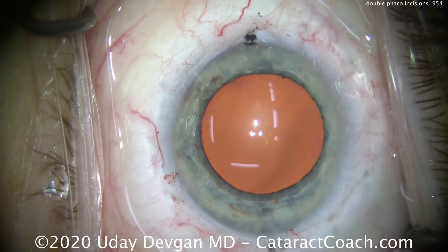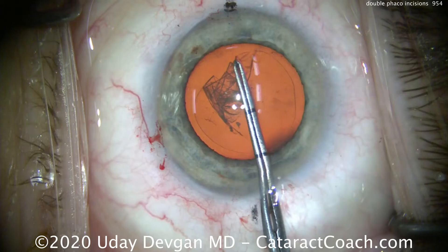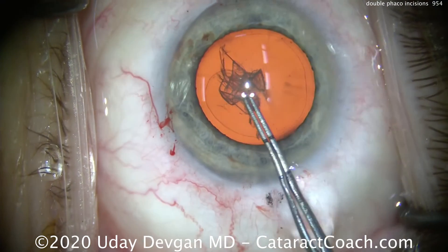Now you have two incisions that are paired, and they're going to help treat against-the-rule astigmatism. They'll give half a diopter to one diopter of flattening, with an average of about 0.75 diopters — and that's going to really help this patient.